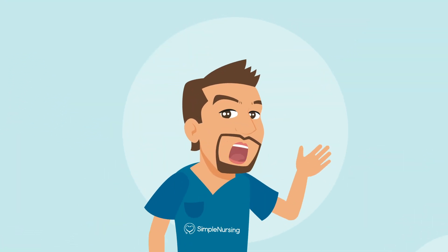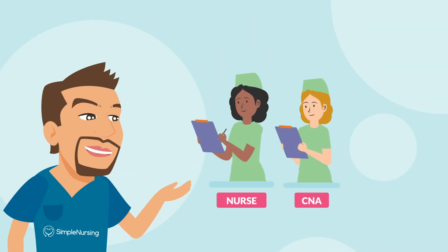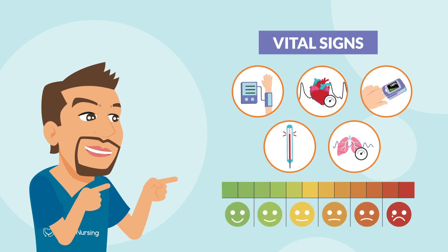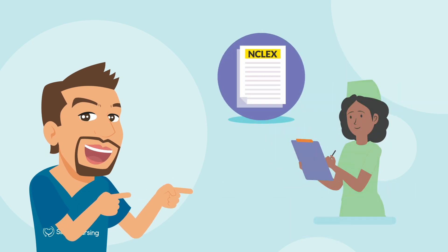Today, we're breaking down one of the most important skills that you'll need as a nurse, CNA, or healthcare pro. And that is checking vital signs. It's vital — not just for the NCLEX, but for real-life patient care.